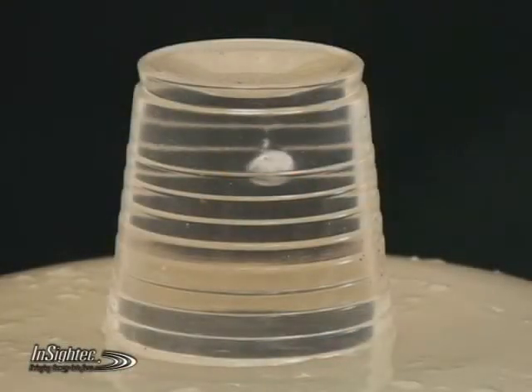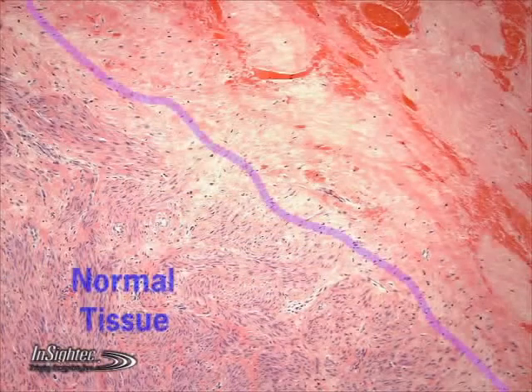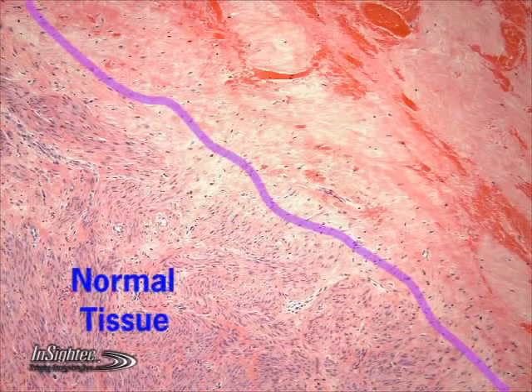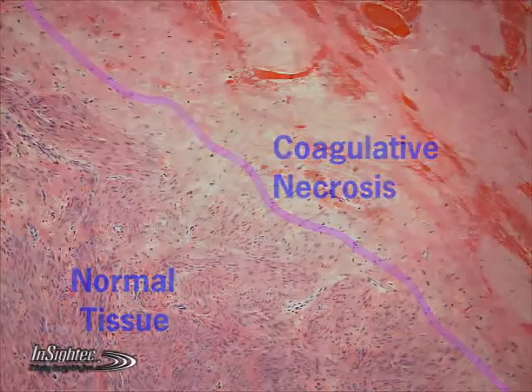This demonstration on a phantom gel shows how focused ultrasound energy affects one focal point, while the rest of the matter is not affected. This results in areas of protein denaturation, irreversible cell damage, and thermocoagulative necrosis with a sharp delineation between them.